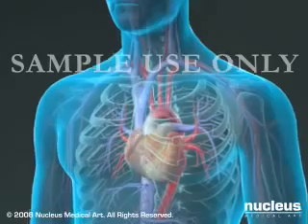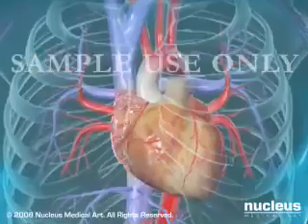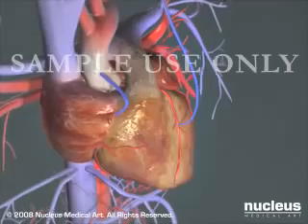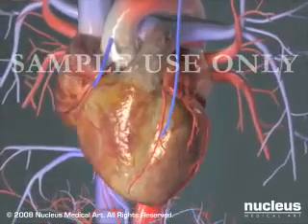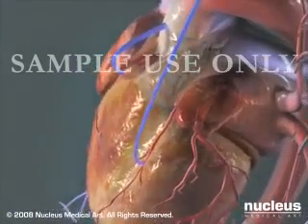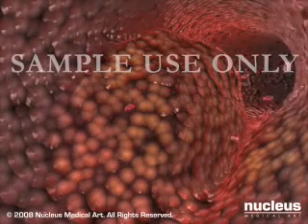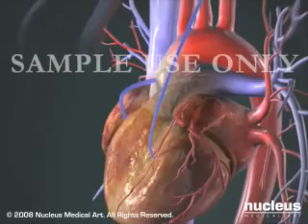A coronary artery bypass graft, or CABG, is performed to improve circulation to the heart muscle in people with severe coronary artery disease. In this procedure, a healthy artery or vein from another part of the body is connected, or grafted, to the blocked coronary artery. The grafted artery or vein bypasses the blocked portion of the coronary artery, carrying oxygen-rich blood to the heart muscle. One or more coronary arteries may be bypassed during a single operation.